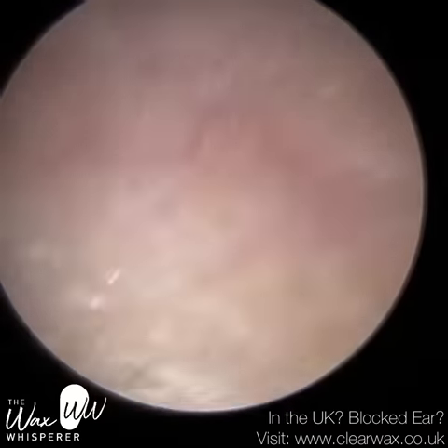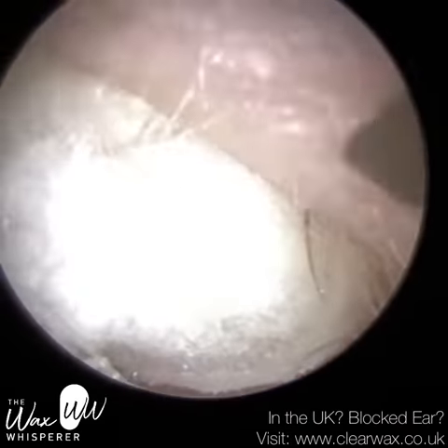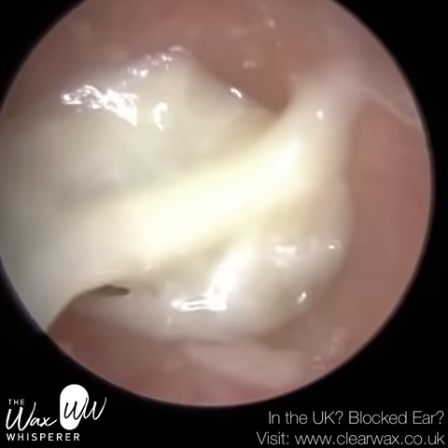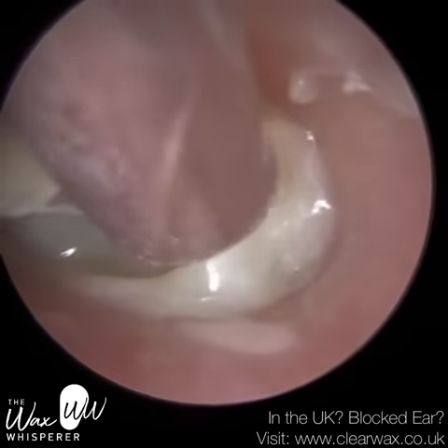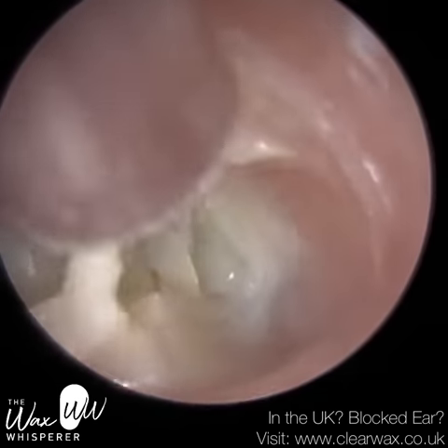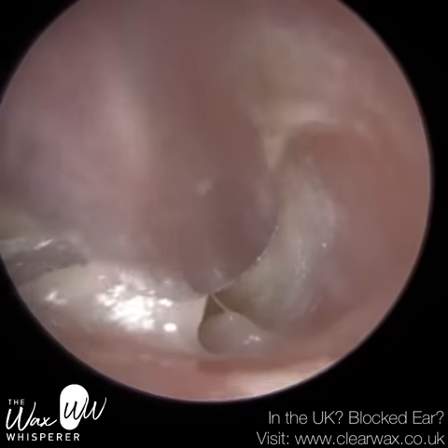In their right ear, they had occluding soft earwax and dead skin. Just to give you a backstory — their case history — they previously visited a high street chain to undergo microsuction. After a couple of attempts they were unsuccessful and they developed an infection in their left ear. It's unknown whether the procedure itself led to this infection or because the patient had been using earwax drops for quite a while. I suspect it's the latter, so I'll explain why and how excessive use of earwax drops can lead to an ear infection.